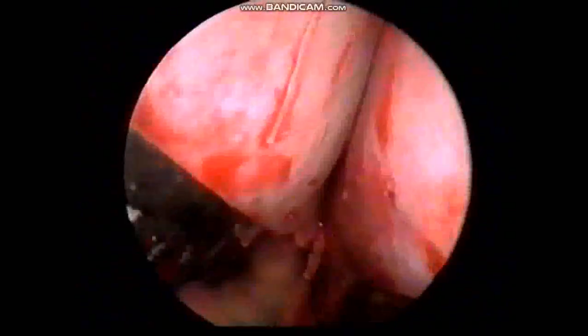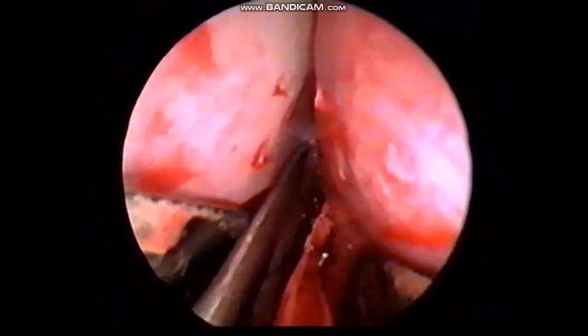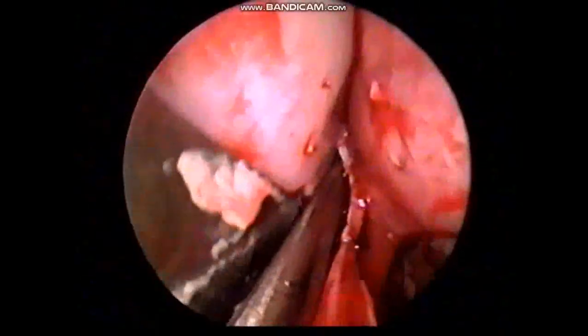You can see the posterior part of the bony septum. The cartilage is detached from the posterior part of the bony septum. There you can see that I am separating the cartilage from the posterior bony septum, and the mucoperiosteum of the posterior part of the bony septum is also elevated. There you can see the posterior part of the bony septum, which is completely separated from the mucoperichondrium on both sides.